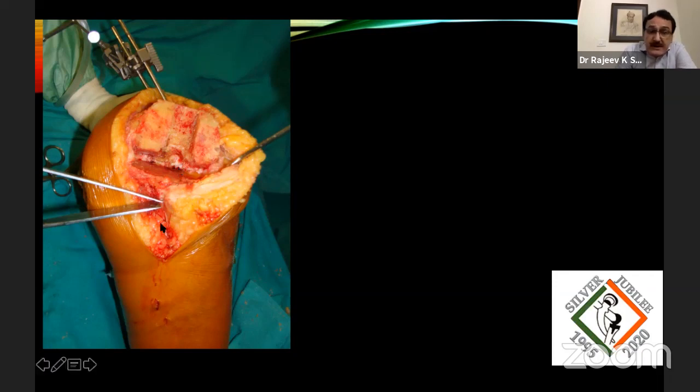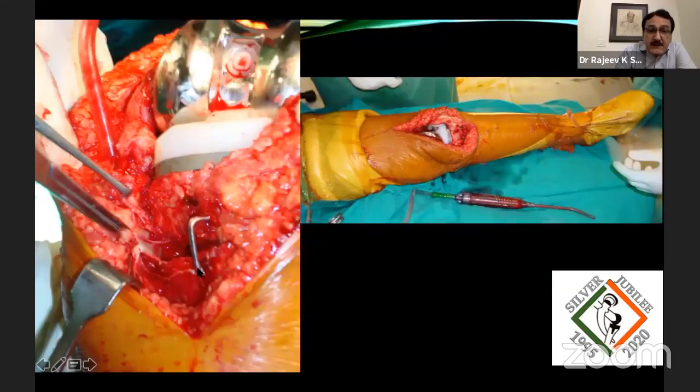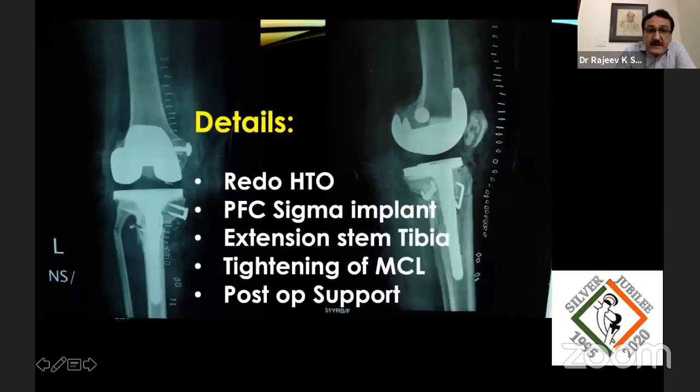And then at the center of the axis of deformity, we did the high tibial osteotomy. And that was the situation. The osteotomy CORA was almost here. We did the osteotomy. Initially fixed it up with a staple. Used the normal PFC Sigma implant. Extension stem in the tibia, tightening of the medial collateral ligament, and of course, this patient was given some amount of post-operative support as well.